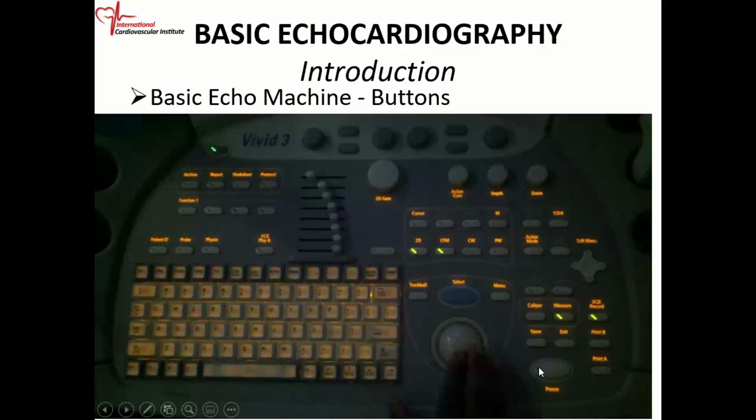You can freeze. It's important that you have a freeze button. You freeze the image because you want to do measurements. If you're going to do measurements, you freeze the image, and you can either use calipers. With calipers, you do some quick measurements. If you want to do comprehensive measurements, then there's a measurement package that you go into and do your measurements. And again, you can record what you're doing.